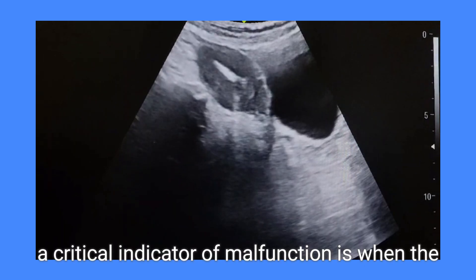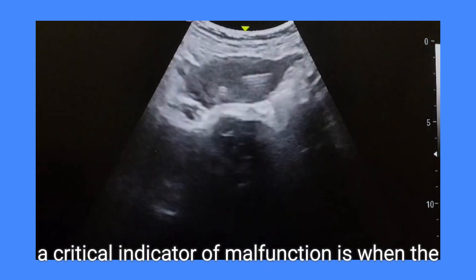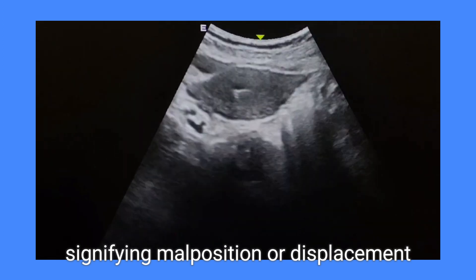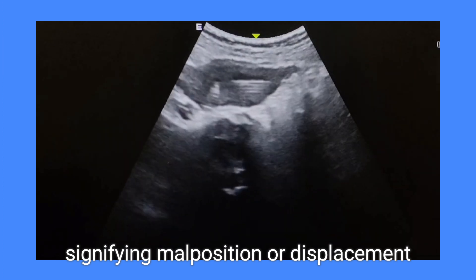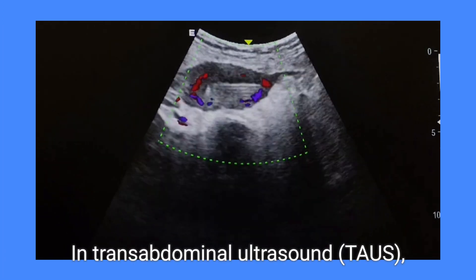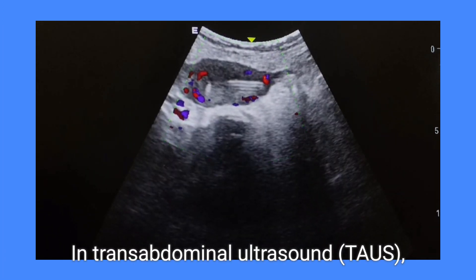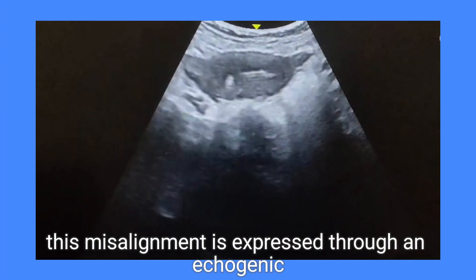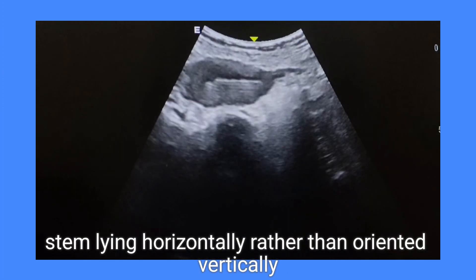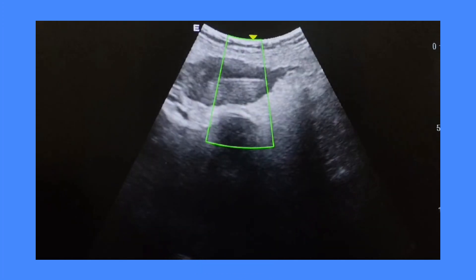However, a critical indicator of malfunction is when the vertical bar presents horizontally, signifying malposition or displacement. In transabdominal ultrasound (TAUS), this misalignment is expressed through an echogenic stem lying horizontally rather than oriented vertically.